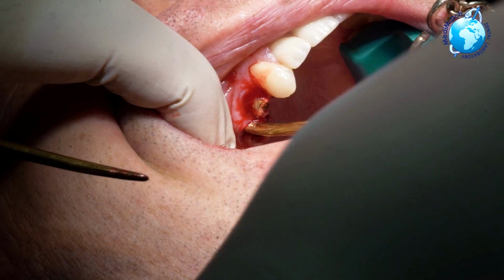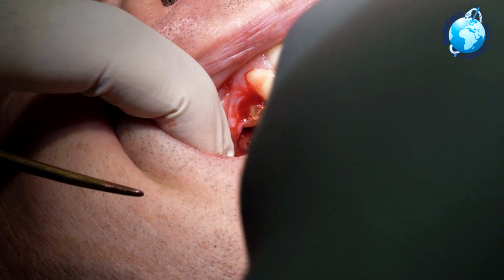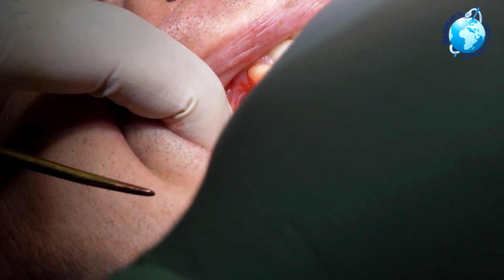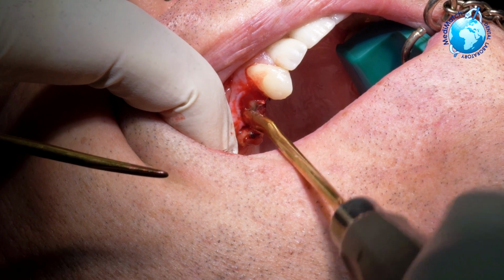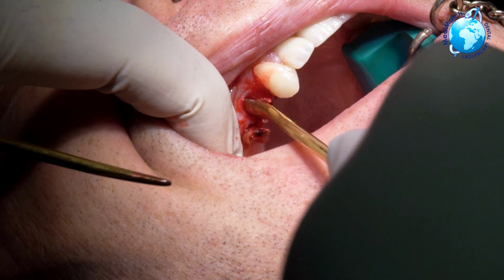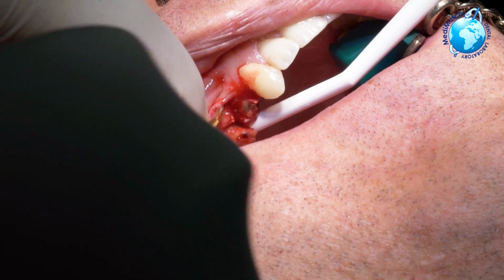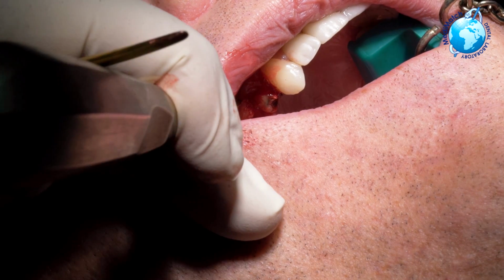Okay, that's fine. I'm going to rotate that fella. Real rotation. Nearly there, Alan. Yeah, it's all good. Right, and I'm just going to bring that papilla. Take enough time about that. There we are. Beautiful. Okay. So that's partially moving.